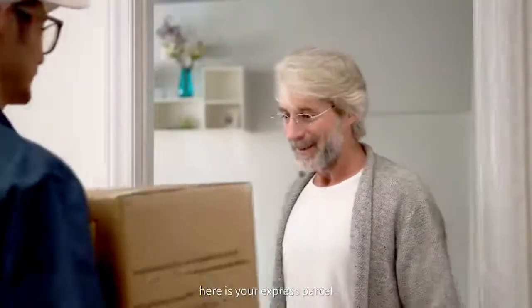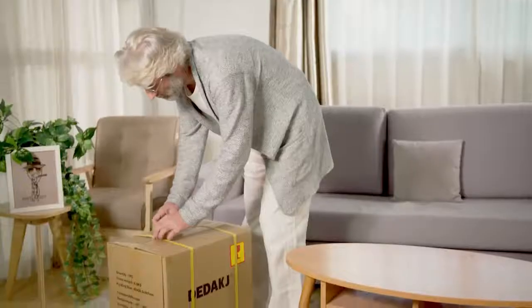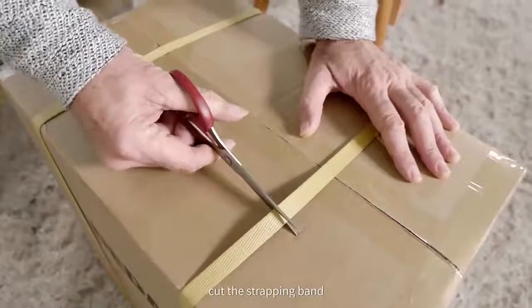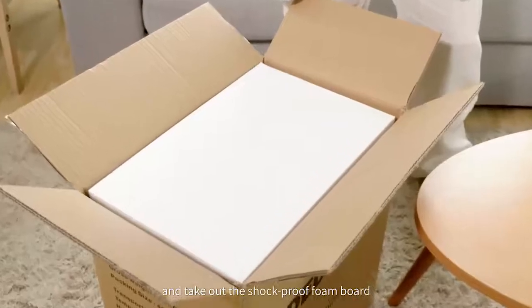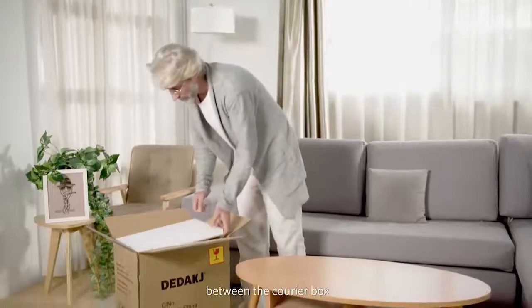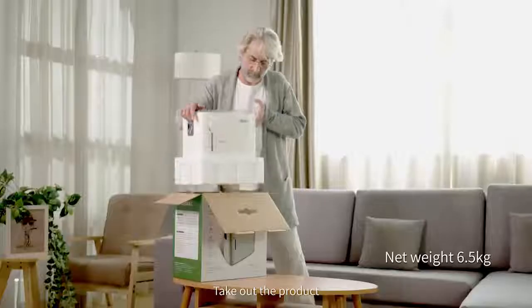Hello, here is your express parcel. Thank you. First, cut the strapping band, then cut the sealing tape and take out the shockproof foam board between the courier box and the product packaging. Take out the product and open the product packaging.